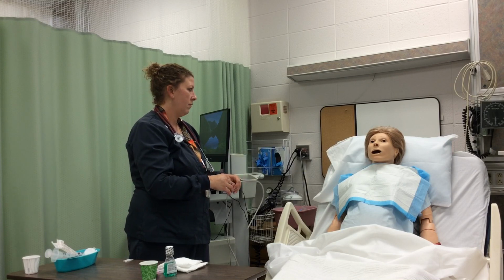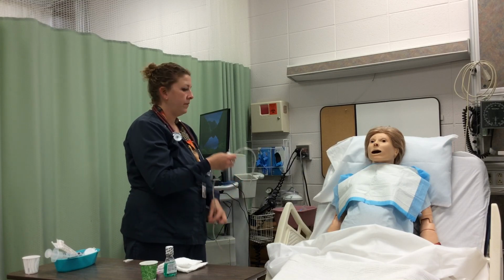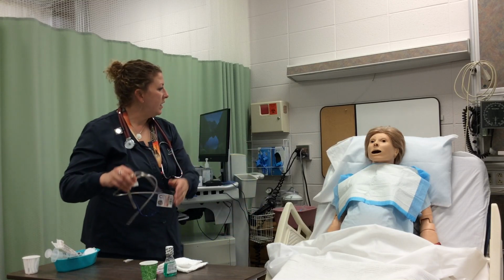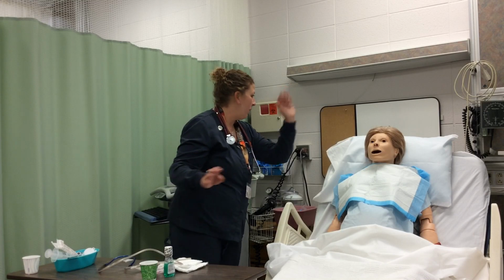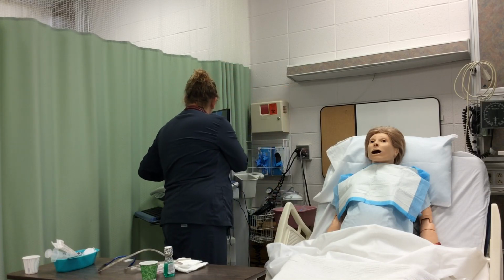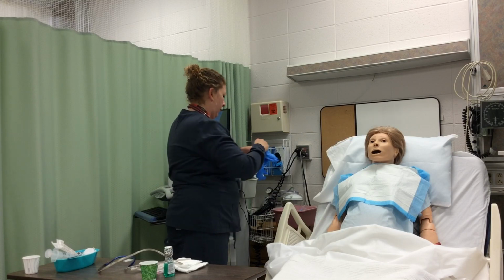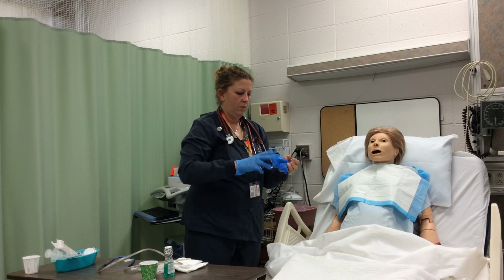Develop a hand signal with the patient so the patient can use it in case of any distress. If you experience any distress while I'm inserting this nasogastric tube, I just want you to wave at me with your hand. Apply water-soluble lubricant to the tip of the tube and apply clean gloves.